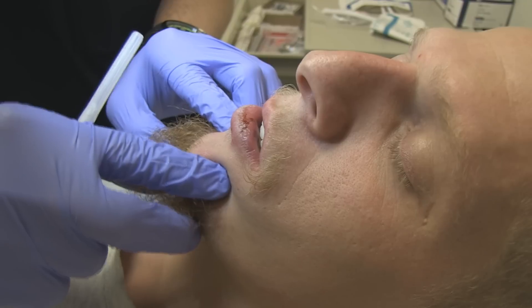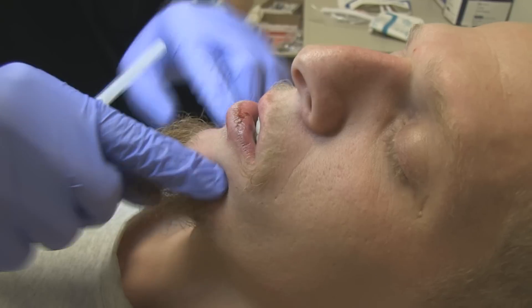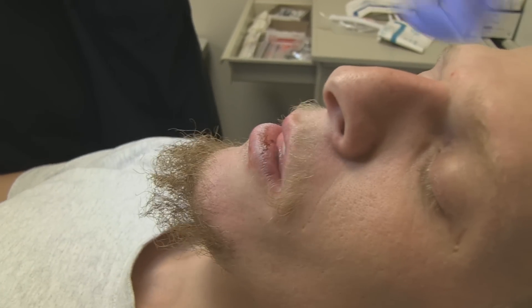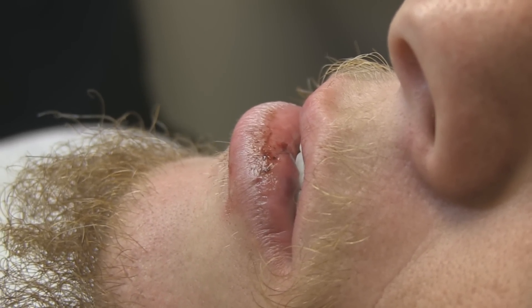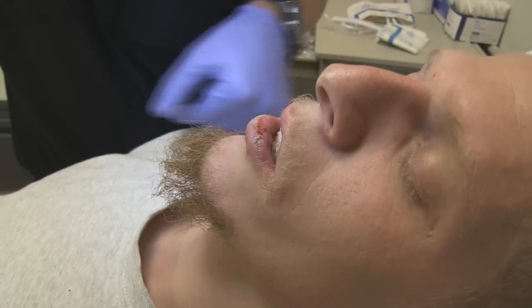You can actually feel a little space there where the mental nerve foramen is. We do not want to get the needle into the mental nerve foramen because it can cause a little bit of nerve damage. Instead, we want to infiltrate some of this Marcaine around the foramen to anesthetize the nerve and the mouth structures which we're going to be working on.